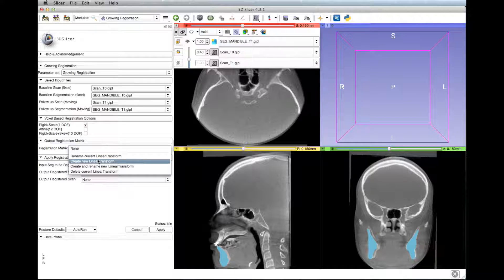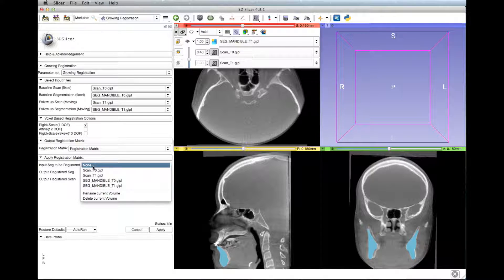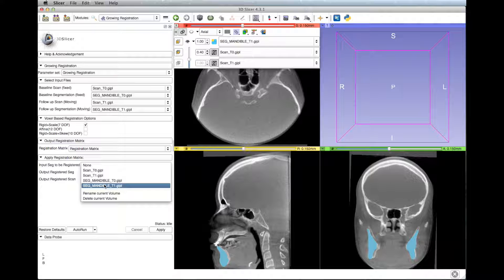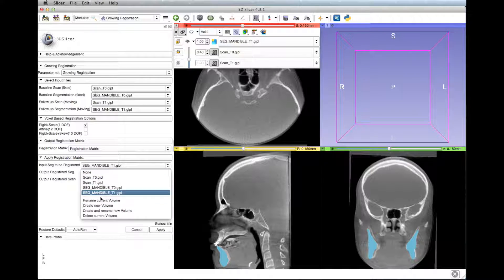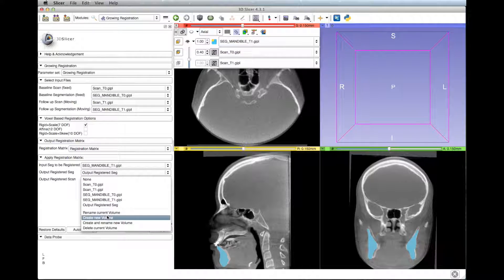The next step is the registration matrix. Select create new linear transform and move to the next option, which is input segmentation to be registered. Select the T2 mandible segmentation. At output registered scan and output registered segmentation, select the option create new volume for both. Then hit the run button.